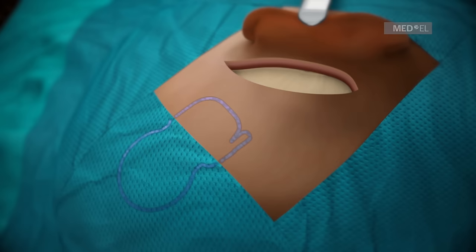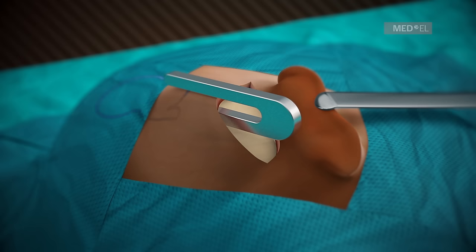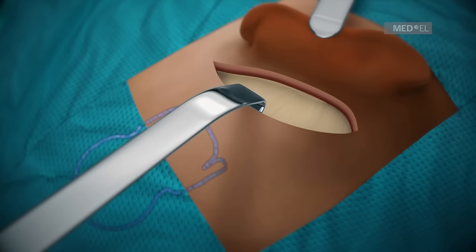Measure the skin flap thickness with the skin flap gauge 6. For optimal magnet attraction and signal transmission, the flap should loosely fit in the gauge. Reducing the skin flap thickness at the coil is recommended when the flap exceeds 6 mm.